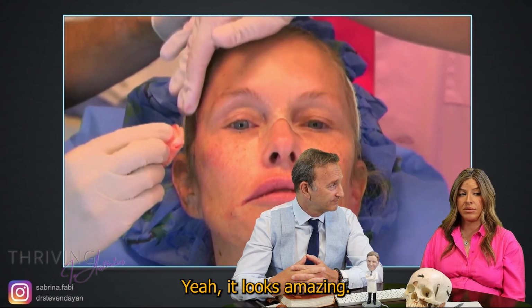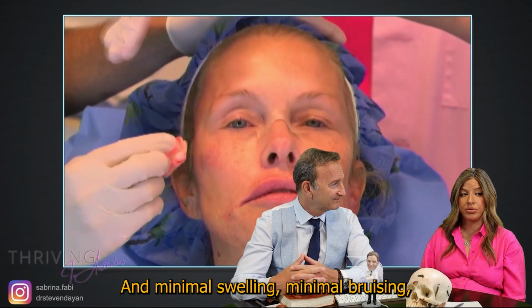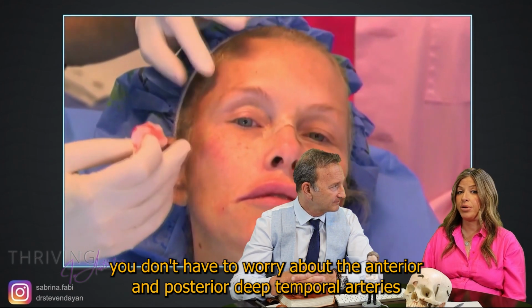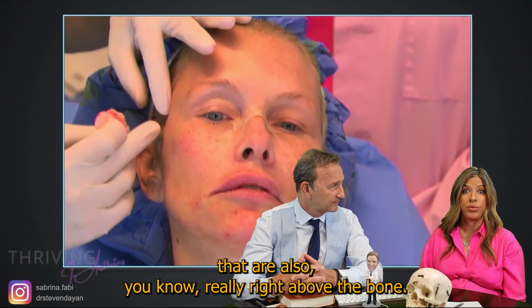It looks amazing. Well, thank you very much. And minimal swelling, minimal bruising. You don't have to worry about the anterior and posterior deep temporal arteries that are really right above the bone.